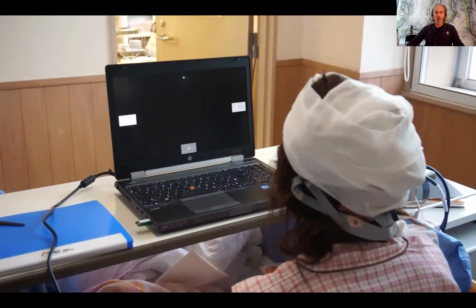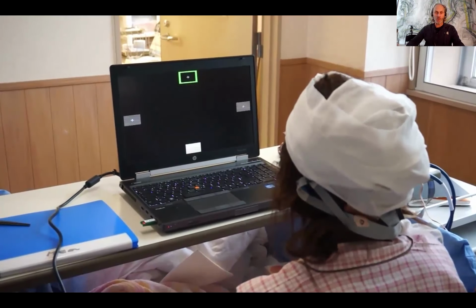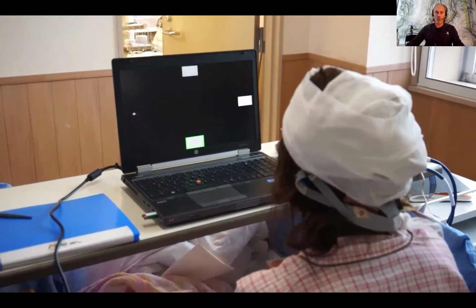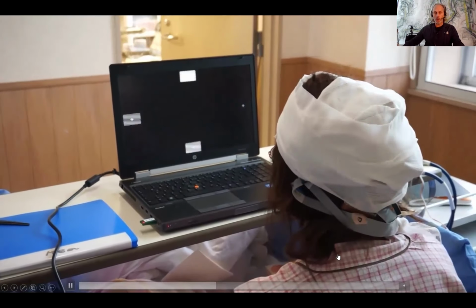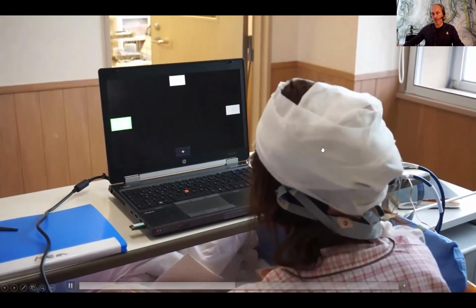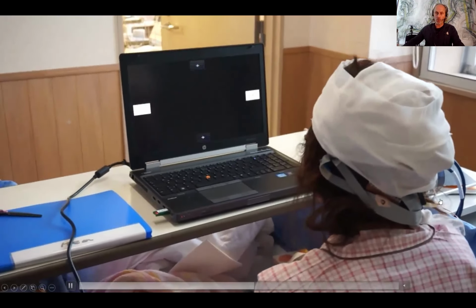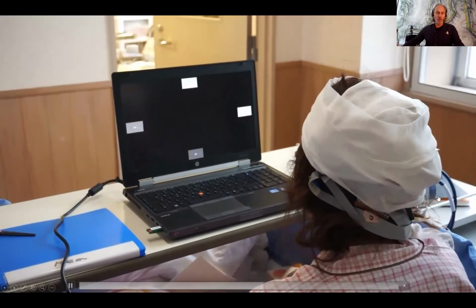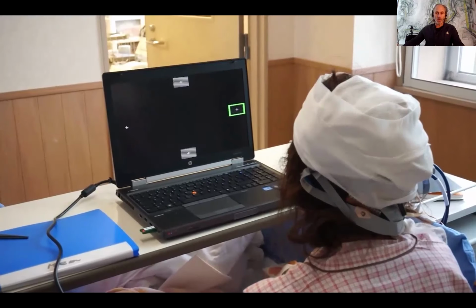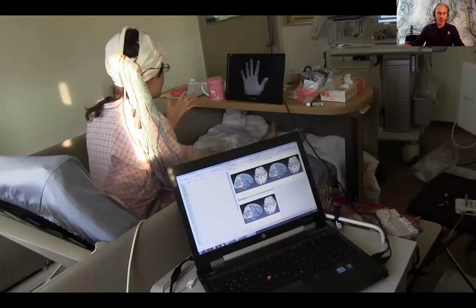And this allowed us to run SSVEP, or in this case c-VEP experiments, also with epilepsy patients, and to look in the ECoG recordings at what we can achieve. And this turned out actually to work very nicely. And also in this recording situation, you can see the cables are coming out of the head of the patient, and they are connected to the g.HIamp. In this case, which is our 256 channel biosignal amplifier, which was developed a little bit later after the g.USBamp.